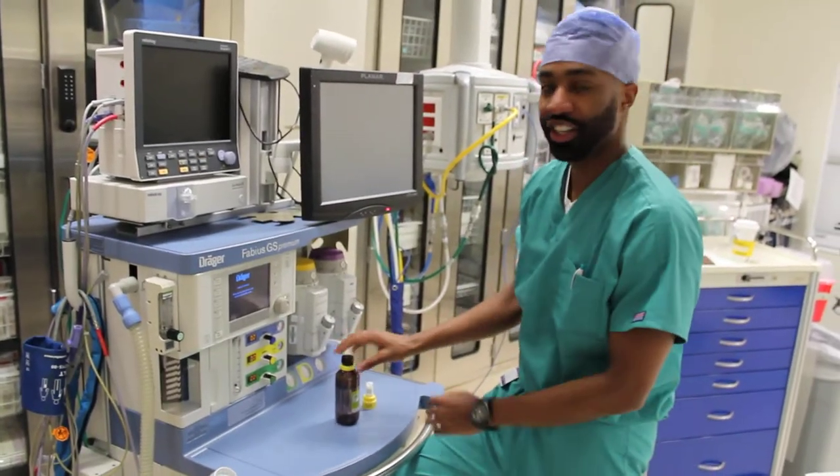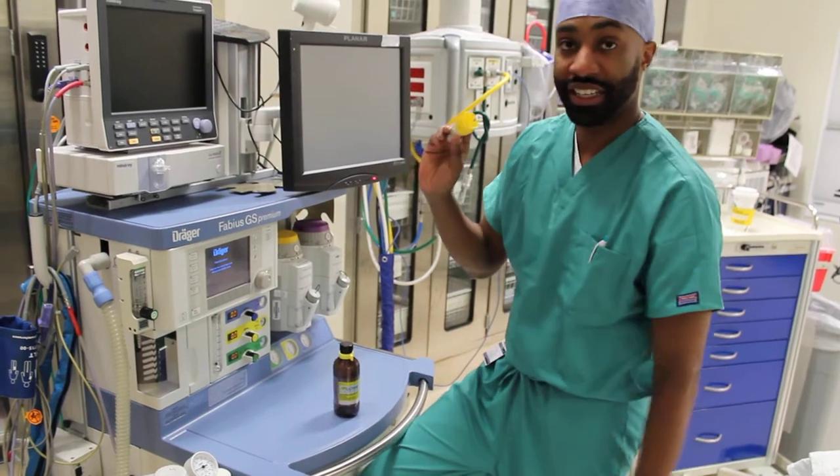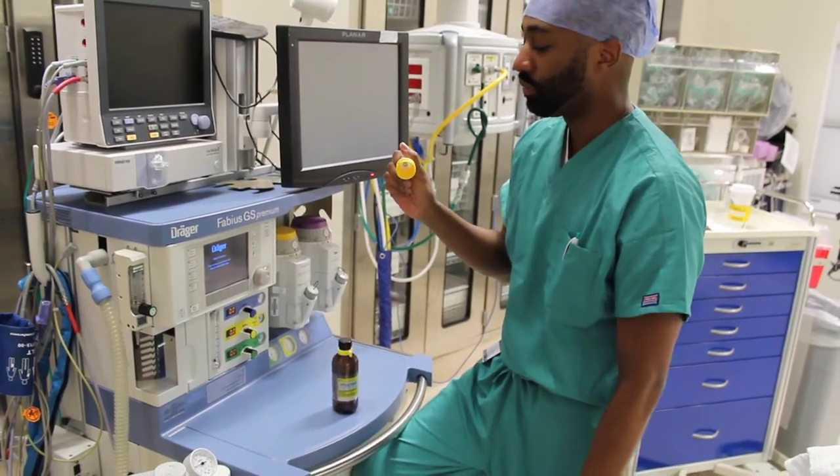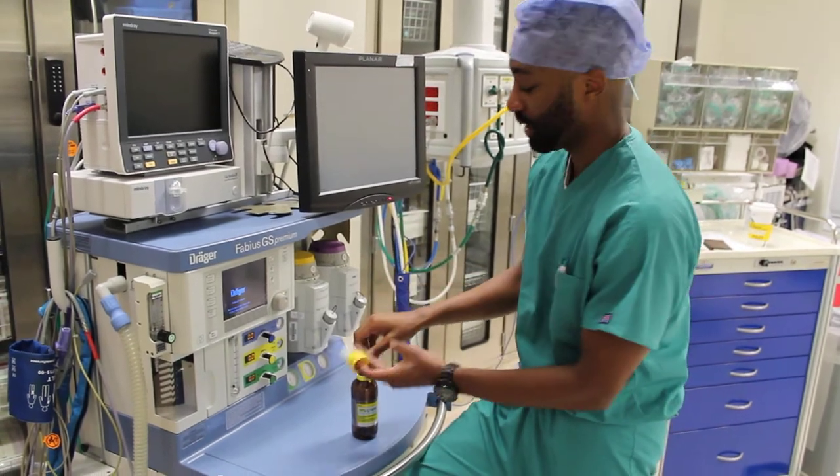Today I'm going to show you how to fill up your inhalation agent. We're going to start with SIVO. First, you have to make sure you have the right adapter, because each adapter is made to fit with one specific gas.